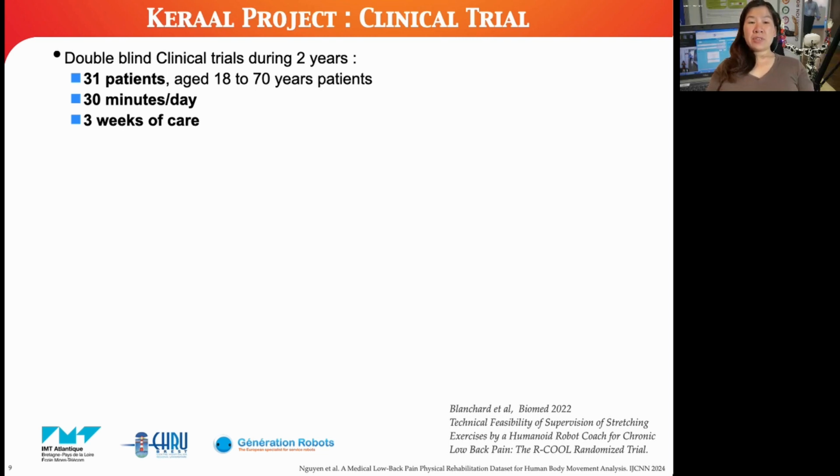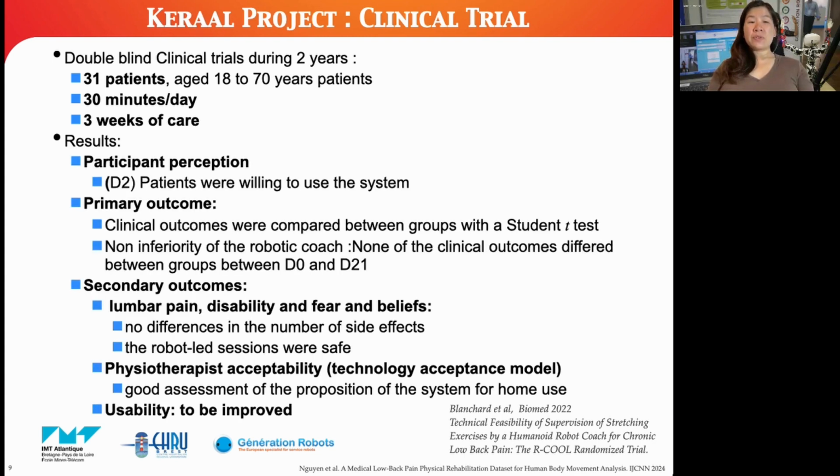From the patients using the robot, we recorded the dataset. This clinical trial also offers results in terms of medical health and acceptability.